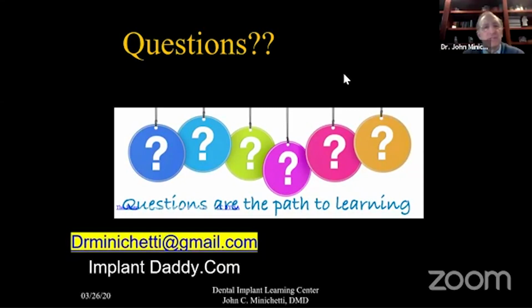Another question, why so many implants? Well, we did individual implants per tooth because we kept the patient's teeth. Certainly another treatment option would have been to put all on 4, but I don't know if I would want to present that as the first treatment option for this patient.